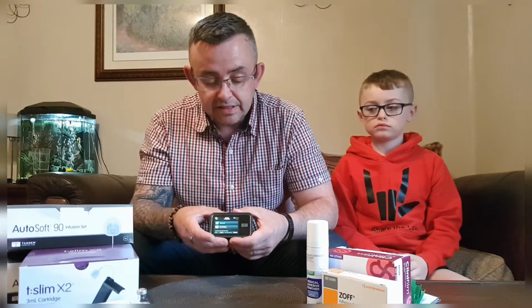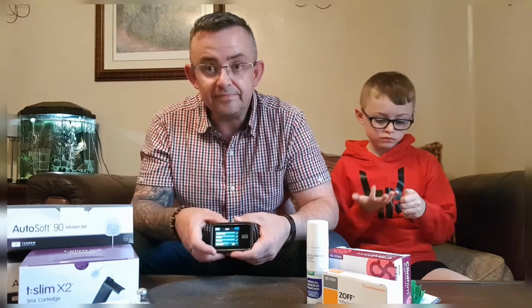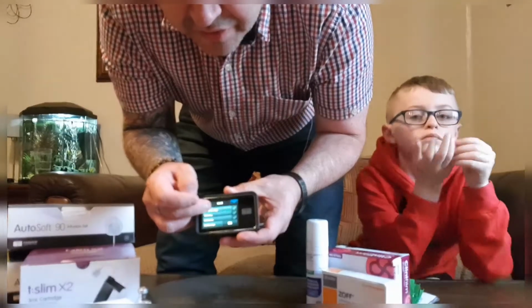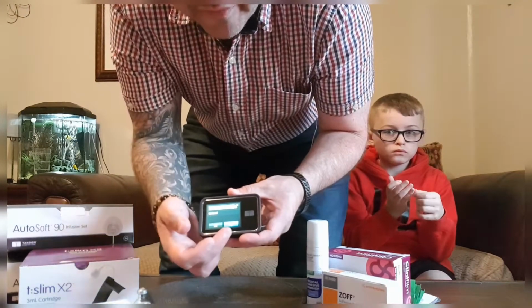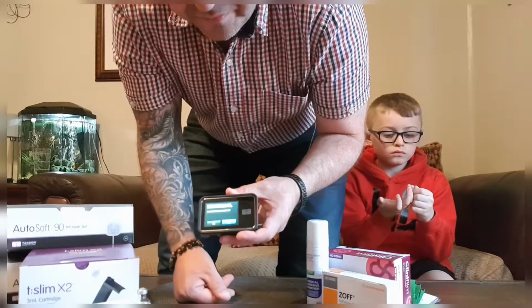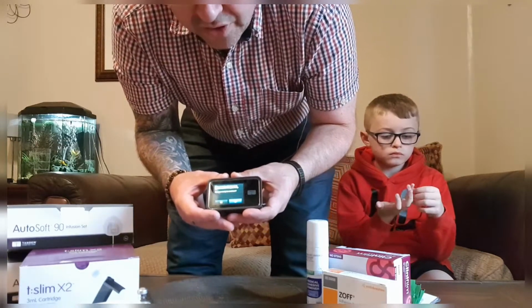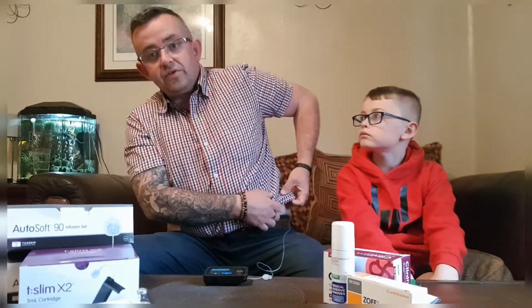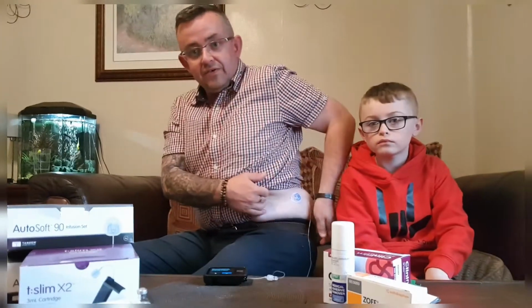So let's get started. We go into options, we go into load, and then we go into change cartridge. In order to change a cartridge, all insulin deliveries will be stopped. Tick that. All deliveries stopped. So now it's saying make sure the insulin set is disconnected from your body. Are you ready to continue? So we need to disconnect this. This is where I've got it at the moment. It's right around here. Can you see? All the way around there.